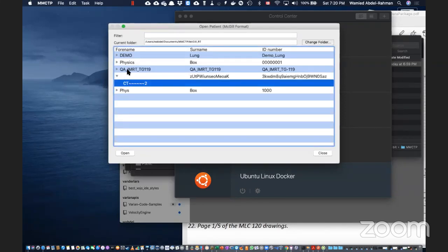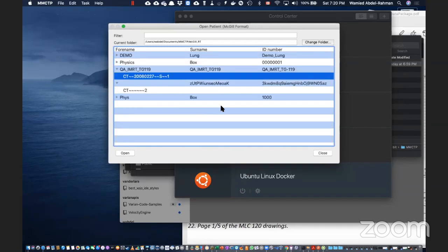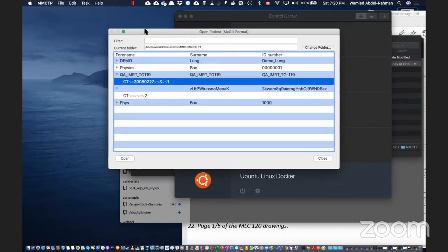Okay, do you want to discuss something, or should I show the problem that I faced with my beam model? Well, what I was going to discuss today was calibration of DOSXYZ. That's an important topic, I think. Okay, do you want to go first? Yes, let's do it then, because I think that's important.